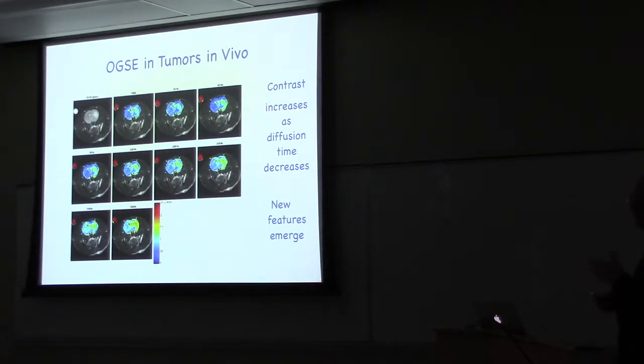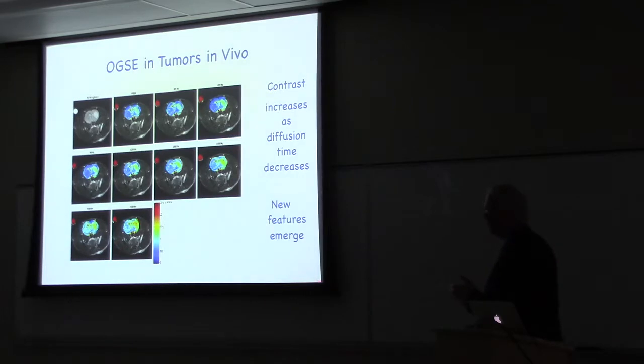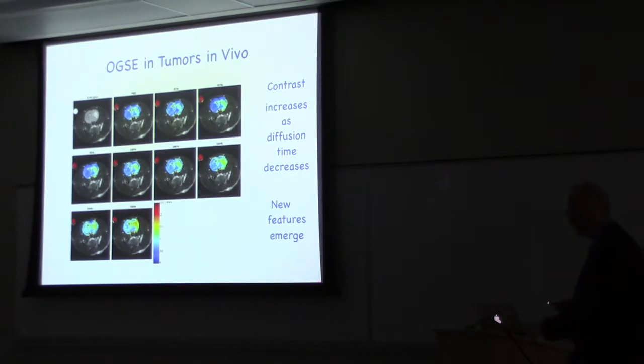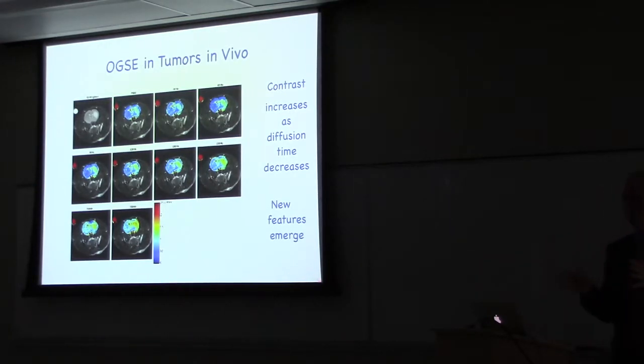And that's because not all the cell sizes in the tumor are the same. And by going to these higher frequencies, we can distinguish between those to some degree because they have different ADCs. So normally when people are talking about measuring this diffusion property in clinical trials, they're making this one measurement, which is uniform everywhere, but in fact, depending on how you measure, you would get different results. So we thought, well, because we're seeing new structure, and we think this new structure is associated with subcellular dimensional changes, maybe that's an earlier indicator of treatment response.